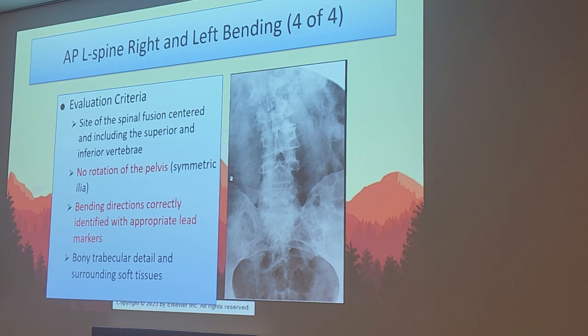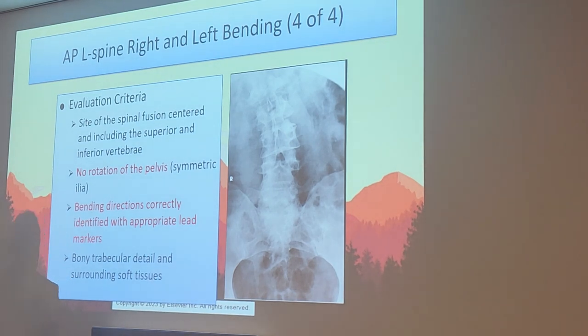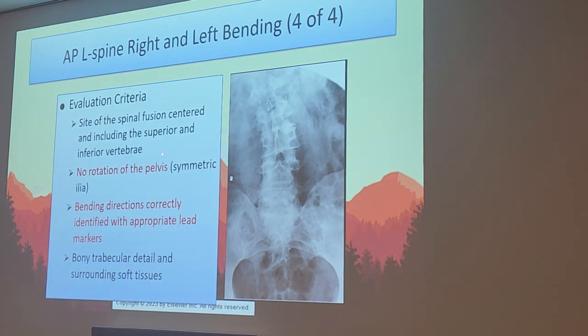All right, so evaluation criteria. If there's a spinal fusion, you want that centered. You want to include the superior and inferior vertebrae when the fusion took place. Of course, as with all our AP views, no rotation of the pelvis. This can be difficult to achieve because we're bending the top of the body. We're going to move those hips, so you got to be careful. Make sure you cross those legs, keep them stable. We want the bending directions correctly identified with the appropriate markers. To answer your question, Jay, there it is right there. You're going to mark the side you're bending towards. And of course, your detail as usual.